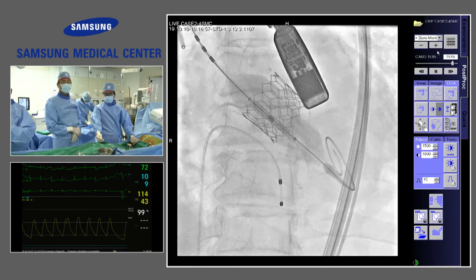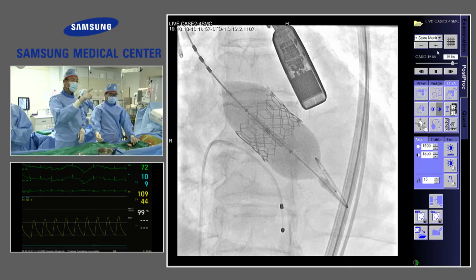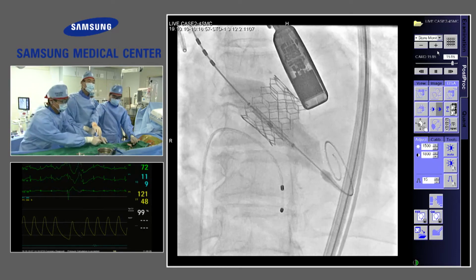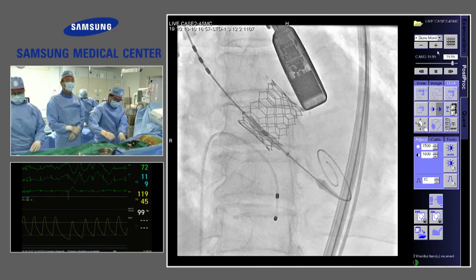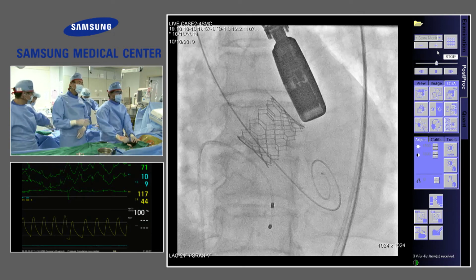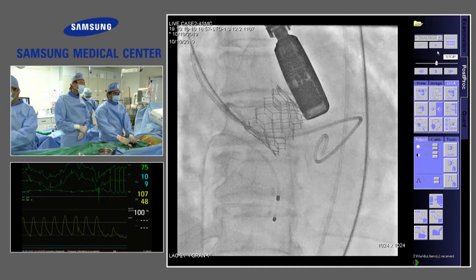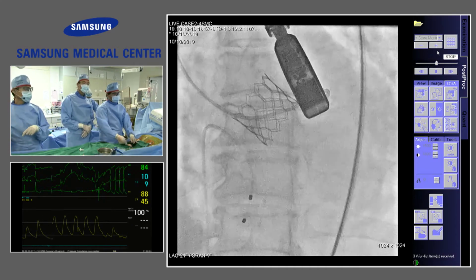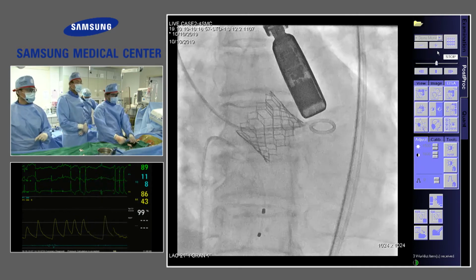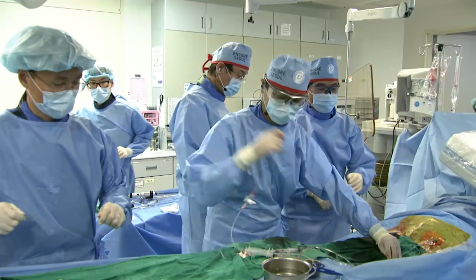Dr. Gwon, we will move to the SNU and we will be back. At the comment, actually, TEE is a very good tool to differentiate the central AR from PVL. That's why monitoring the TEE during the procedure is better, because angiography only is not a good indicator of the PVL when central AR is large. So thank you, move on. Very, very nice so far.